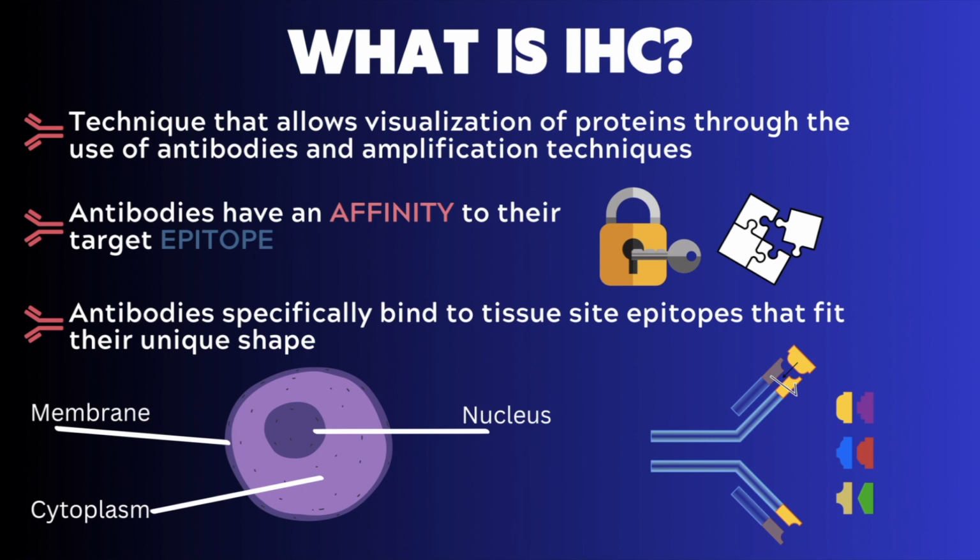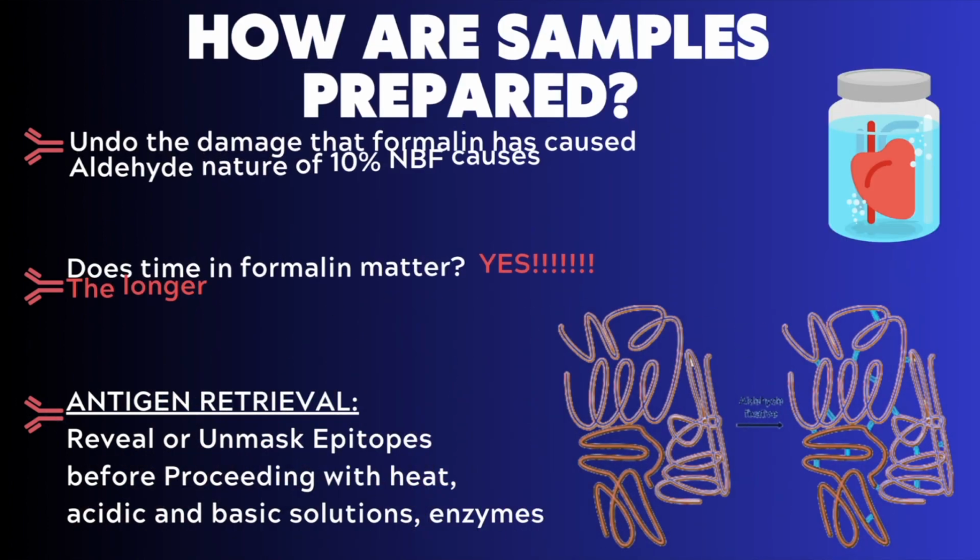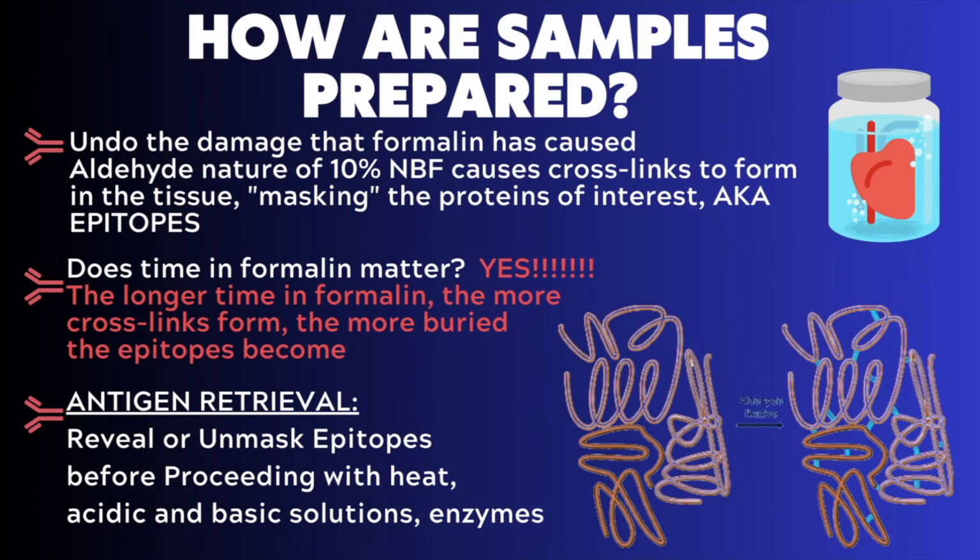How are samples prepared for IHC? I'd like to briefly discuss the pre-analytical steps of immunostaining. I will have a separate presentation on this subject alone. However, I'd like to mention the most important parts.